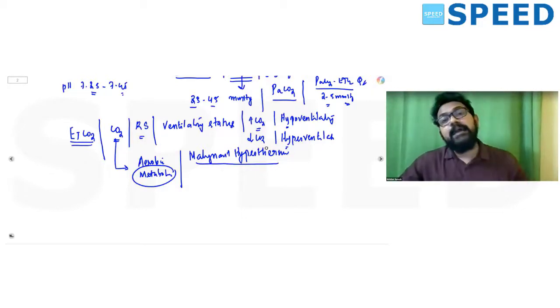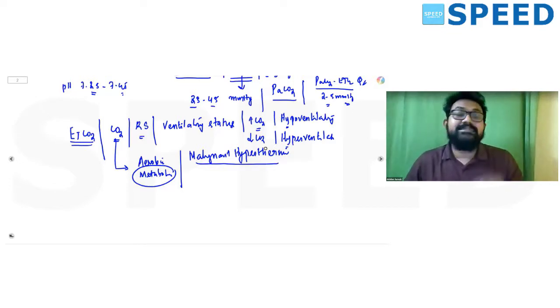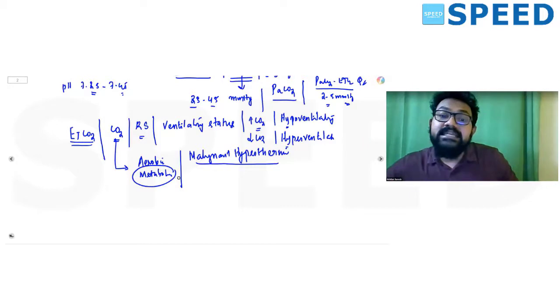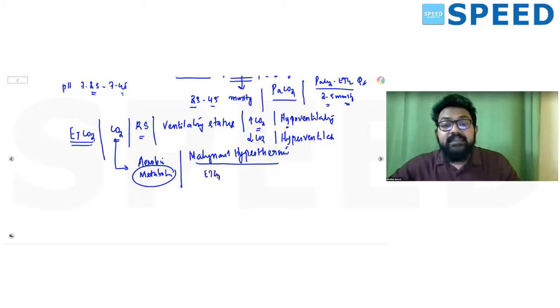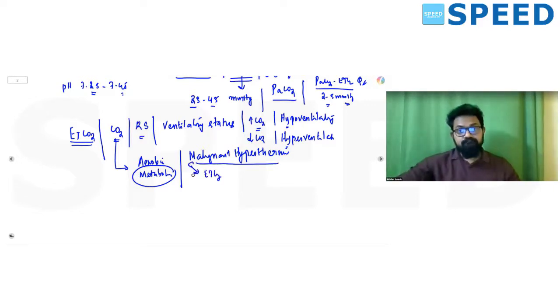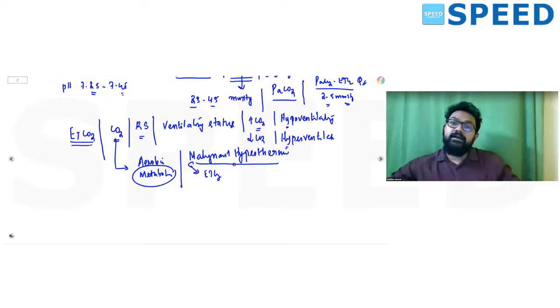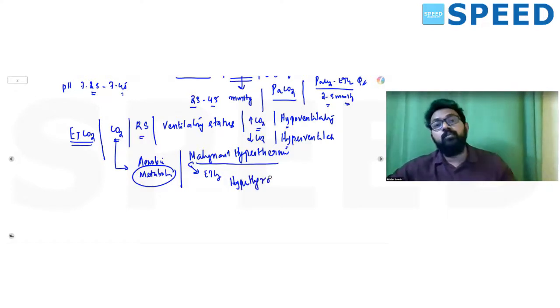Once that happens, the skeletal muscles get driven into a hypermetabolic state, and as a result, there is increased production of carbon dioxide. The earliest intraoperative identification of malignant hyperthermia is done with the help of capnography, and that itself is a question. Similarly, you also have other metabolic conditions like hyperthyroidism, or imagine a patient is having a thyrotoxic storm during the intraoperative period, you will know about that.